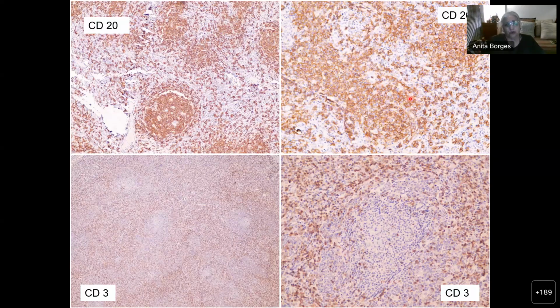But one thing you know, it cannot be a B cell lymphoma. Anyway, could it be a T cell lymphoma? Here is the CD3, and it's everywhere. The CD3 is just diffuse. It's small. These are not big B cells. And then again, you notice these funny collections of maybe mantle cells, but they don't have germinal centers. They must be B cells because this is CD3 negative. It's not CD3, so it must be something that is expressing CD20, which is not coming up over here.